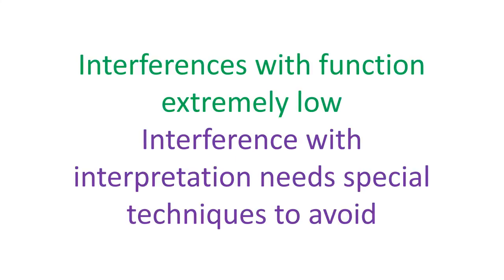A study published in 2020 showed the usefulness of CIMAR in 122 clinical CT studies of the heart with implanted metal. CT coronary angiography can be done safely in persons with pacemakers, ICD and CRT, as the interference in the function of these devices is extremely low, unlike in the case of magnetic resonance imaging. But there could be problems in interpretation of images, which is being taken care of by special techniques and software in CT machines. In case of MRI also, newer devices which are MRI conditional are available.